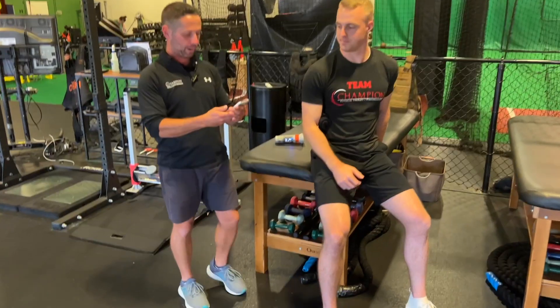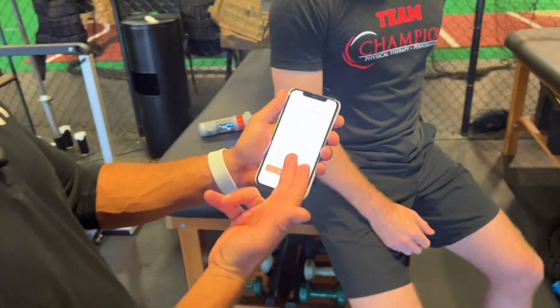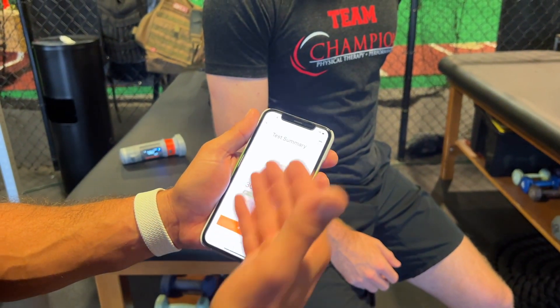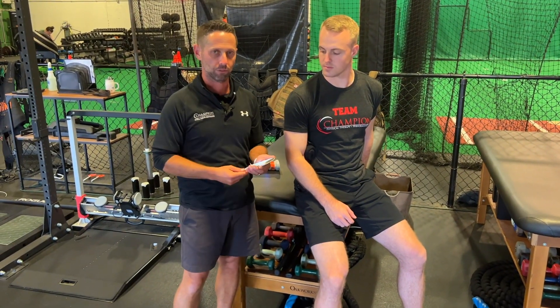Then we'll look at the comparison in the app when he finishes, and it gives us a nice summary showing he's about 12% stronger on the right than the left. It's a great way of visually seeing the asymmetry and being able to talk to him about that. In the future, we'll be able to see this in the vault hub so we can track his progress over time.